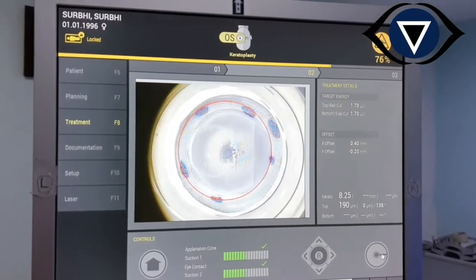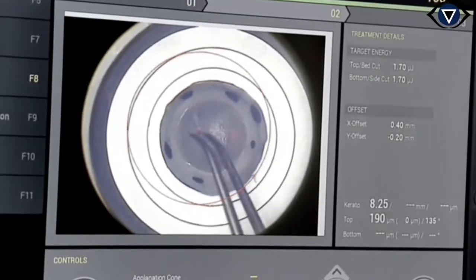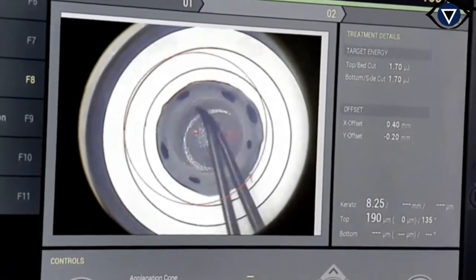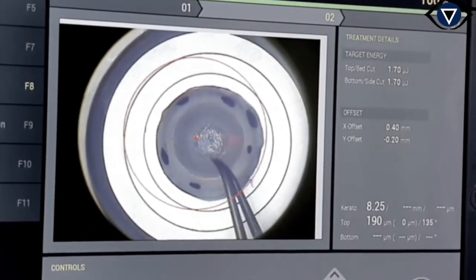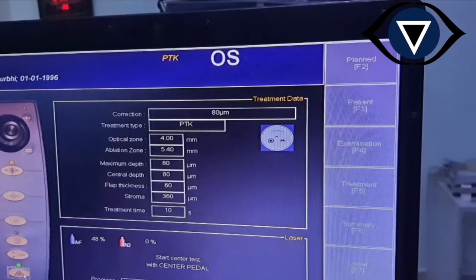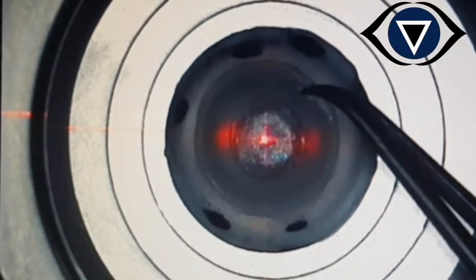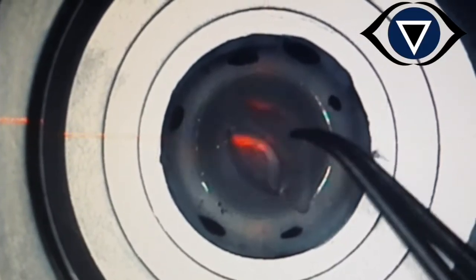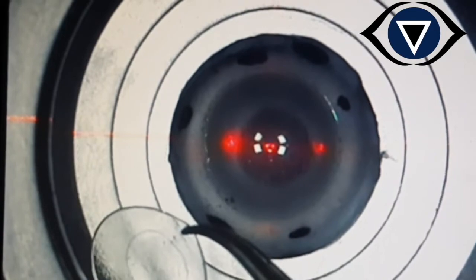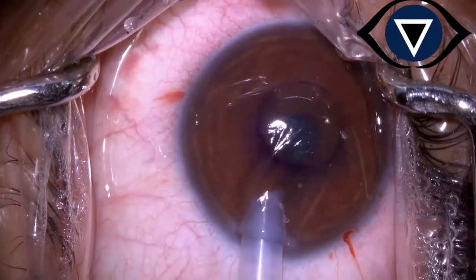Here we can see the femtosecond laser being fired on the donor cornea, which is mounted on an artificial anterior chamber. In a modified technique, the excimer laser is fired on the stromal side of the inlay to make the inlay into a negative meniscus shape to improve the refractive outcomes after the surgery. So after the inlay is harvested, it is placed in a Teflon block in BSS, after which it is inserted in the stromal pocket of the recipient.